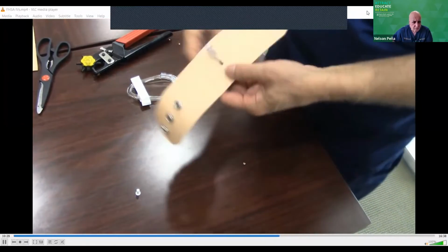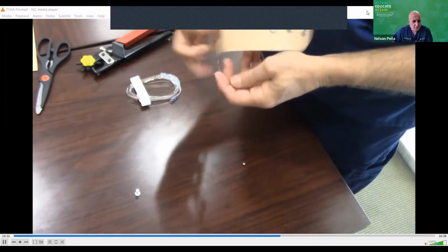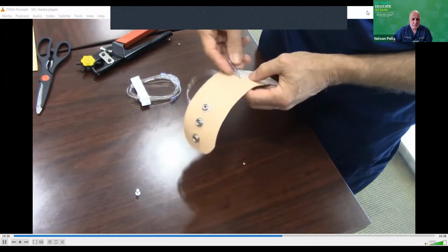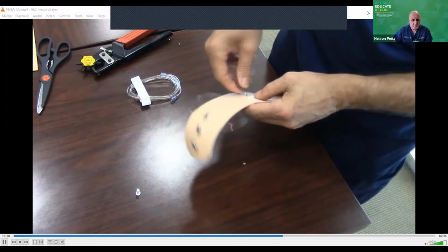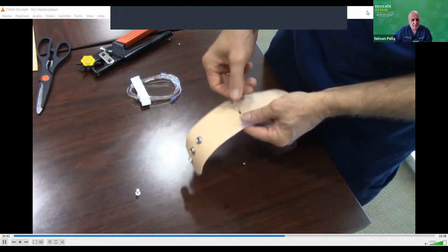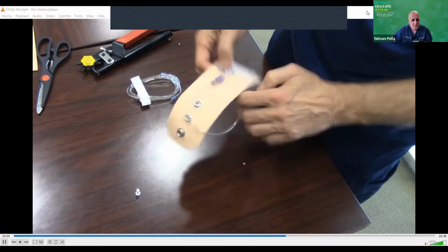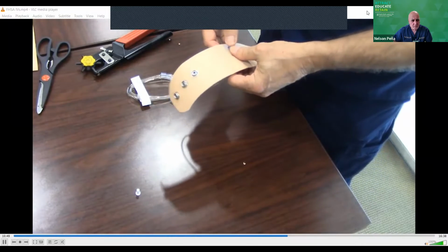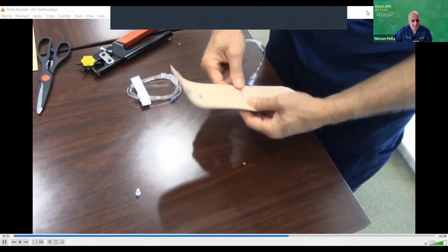Okay, so now that you've got the tubing through there, since it comes curved to begin with, you want to use that to your advantage. So you want to work with that curve rather than working against it, because then the IV hub is going to always want to stand up. So you want to work with the tube. And then what we're going to do is we are going to fasten it on the other side.